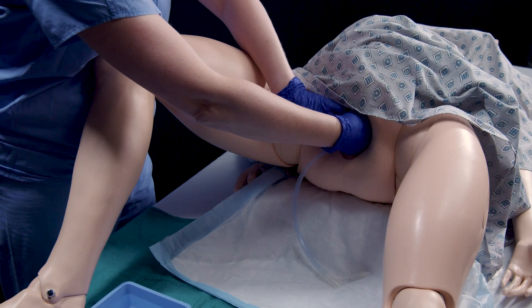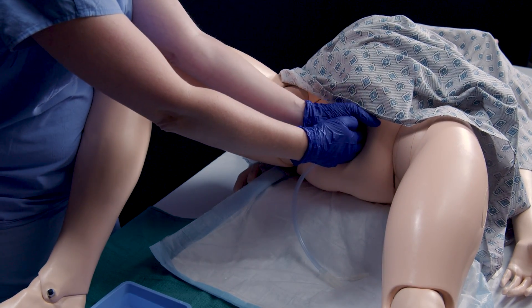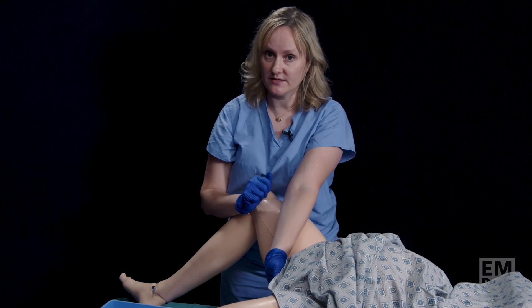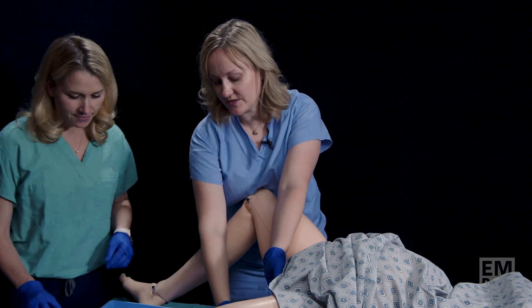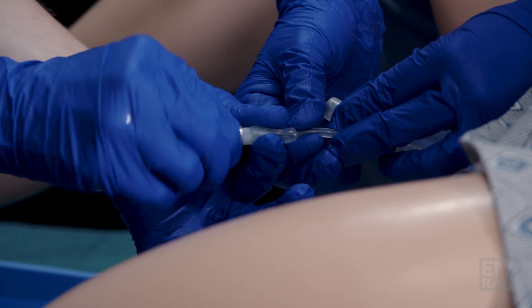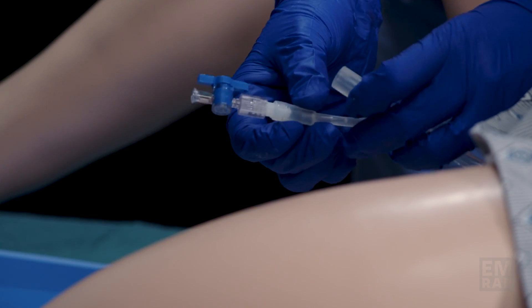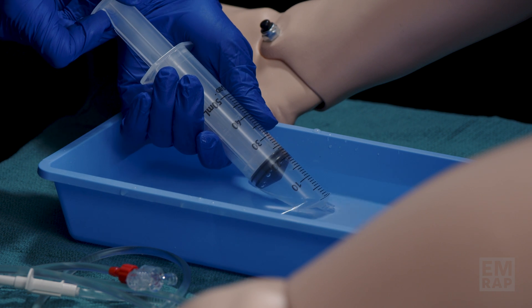At that point, I'm going to hold the Bakri balloon in place with my hand. I'm going to request some assistance and instruct my assistant to attach the stopcock to the end of the device. There are two ways to fill a Bakri balloon — this is the manual way. I'm going to have my assistant draw up 50 milliliters of sterile saline or sterile water.